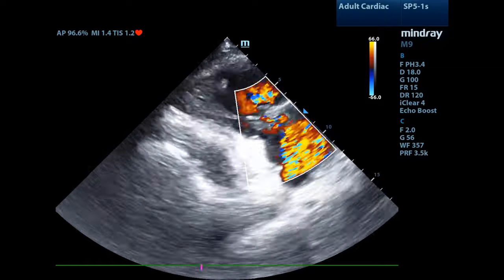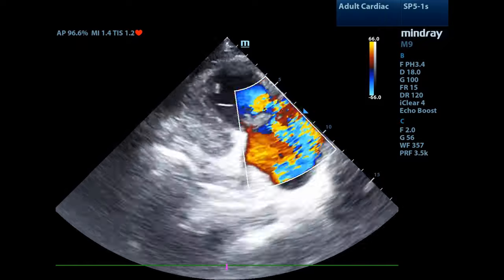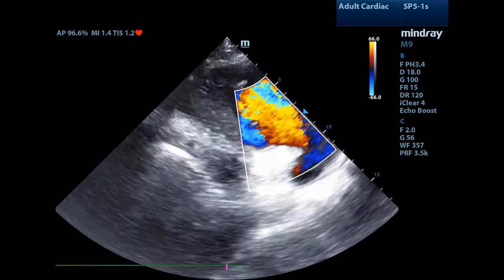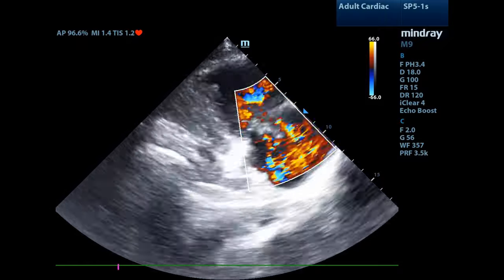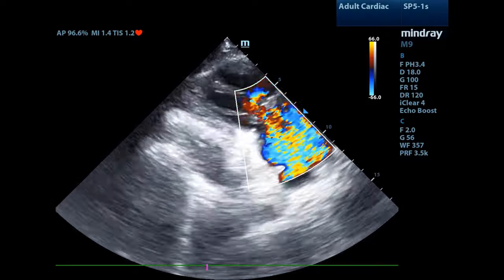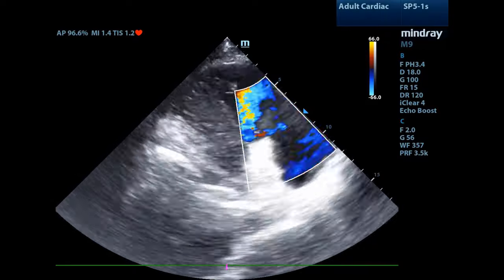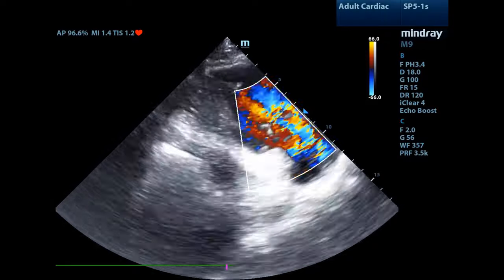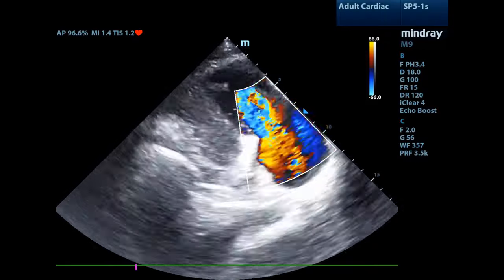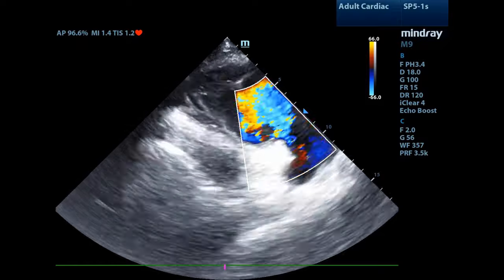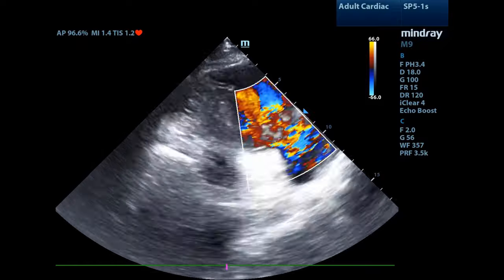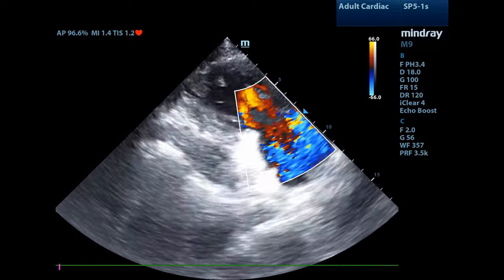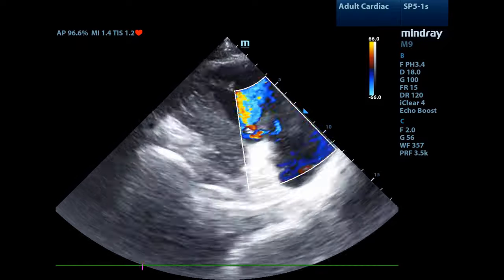I have now placed color flow Doppler across the tricuspid valve. You'll notice that there are bright colors on both sides of the valve, indicating high-velocity blood flow. This brings up the concept of aliasing, where the blood flow is so quick that the ultrasound machine cannot determine the direction of blood flow.